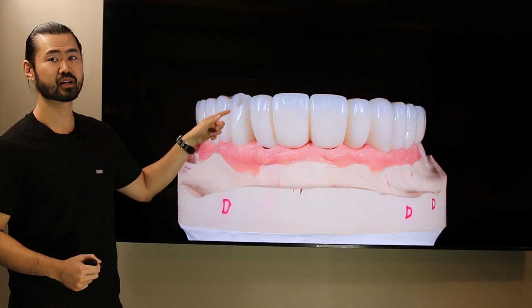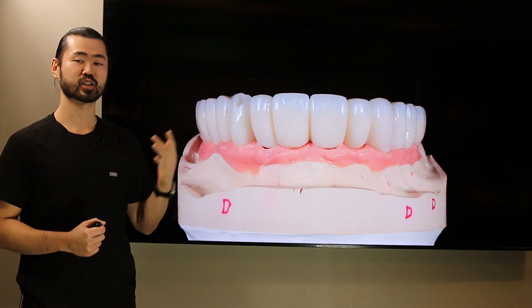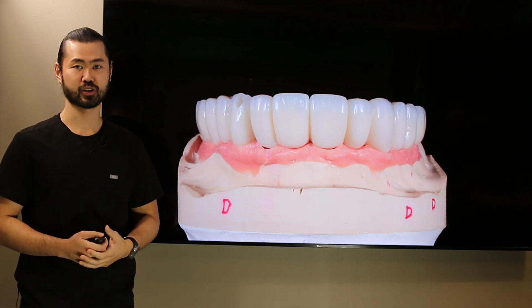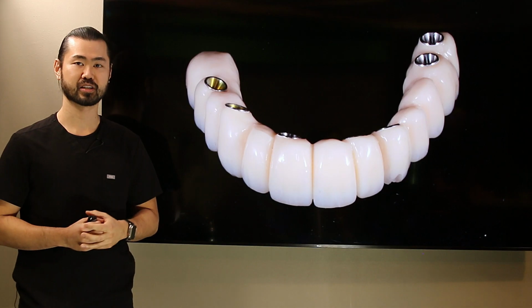Specifically for this patient, those of you with pretty sharp eyes will notice that there is a little hole in the side here, and that's because this particular implant was angulated too far out for us to be able to correct the angle, even with some of the special angle correcting screws that we use. So the way we work around this problem is to eventually close up those restorations with tooth-colored filling material.